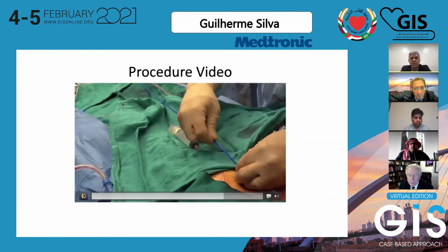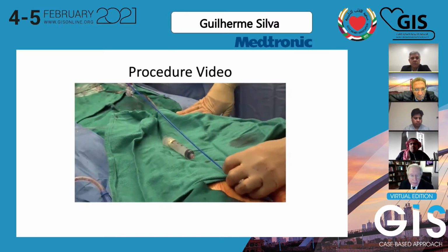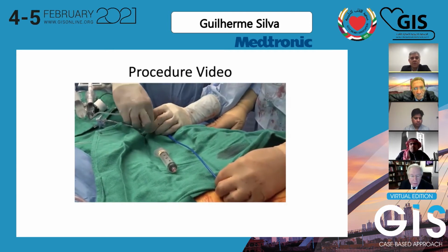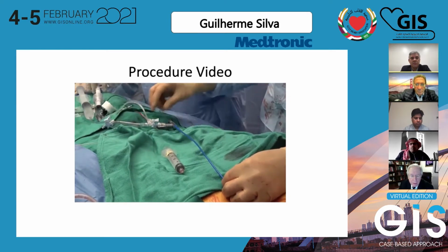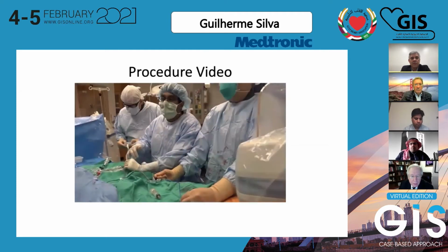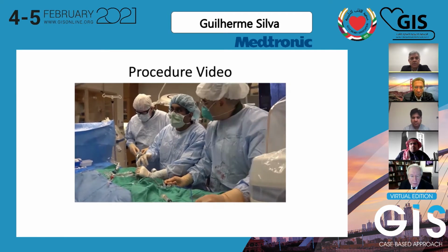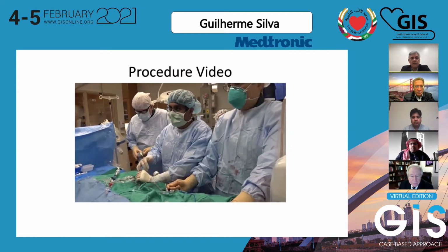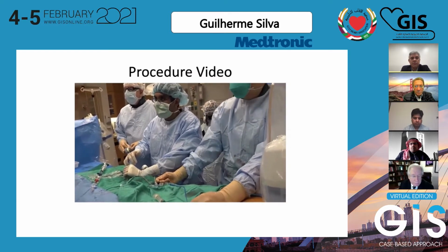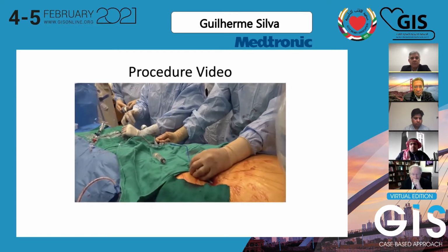So we decided to go in with an 18 balloon because of the issue with the calcium, and we wanted to see if we're going to need to crack this valve or not. We were very concerned about that calcium again because we've seen this. So this is a technique to inflate the balloon inside the valve. You do need the intelliflator, and you need a syringe to fill the balloon. So we're pacing quite rapidly at 180, making sure Dr. Coselli is pacing, Dr. Simpson is there, and I'm at the balloon.